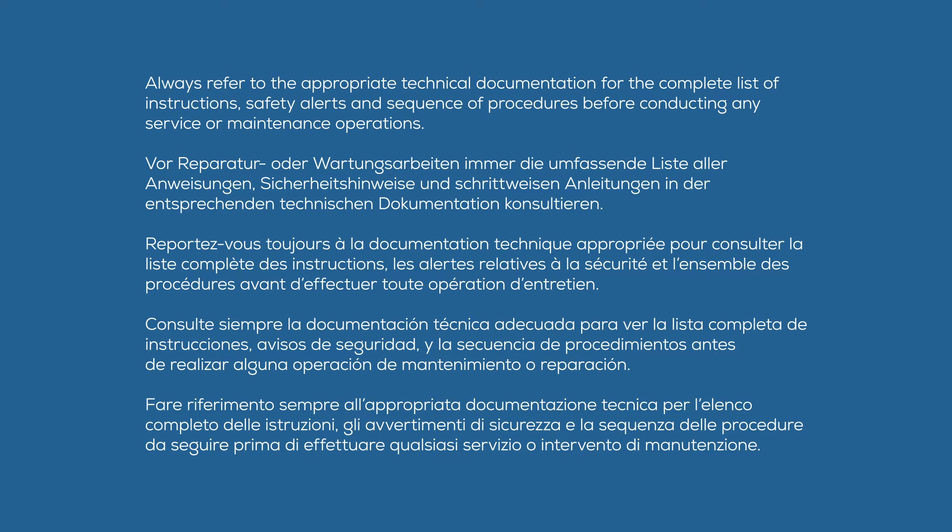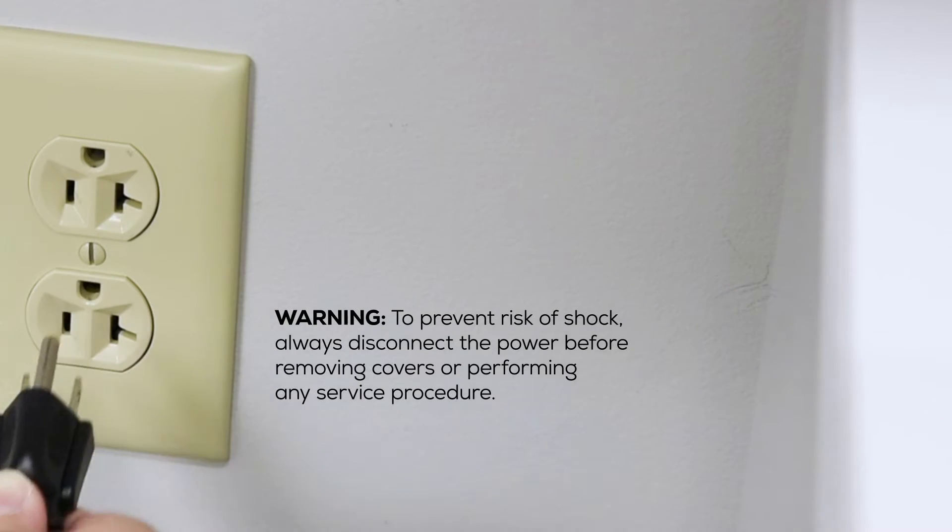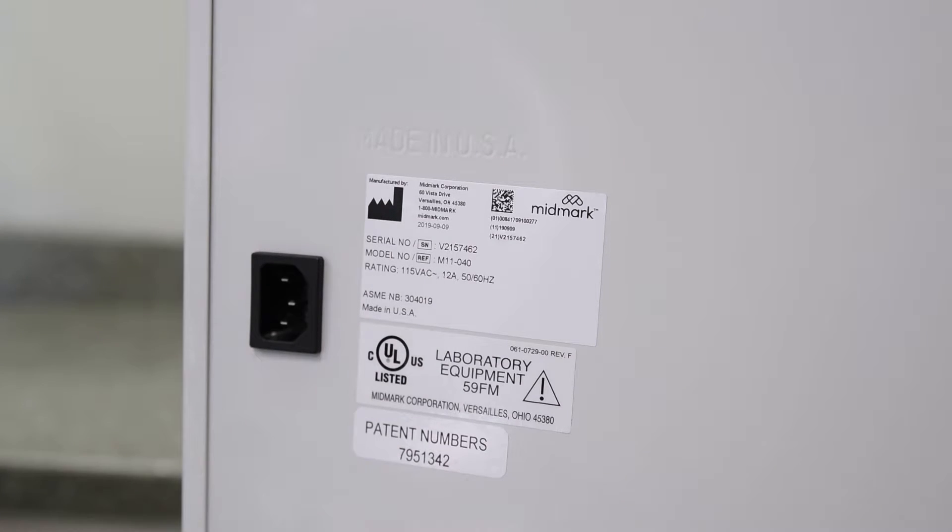Always refer to the appropriate technical documentation for the complete list of instructions, safety alerts, and sequence of procedures before conducting any service or maintenance operations. To begin, unplug the power cord from the wall outlet or power inlet on the back of the sterilizer.